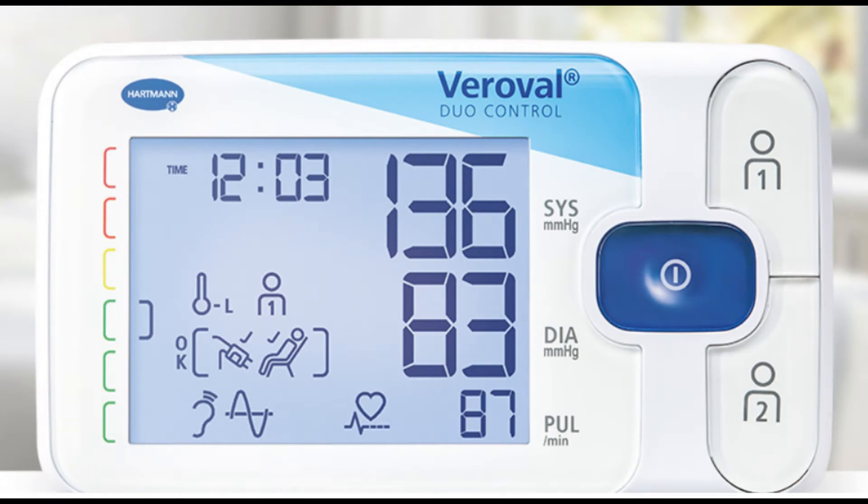The Variable Duo Control can be used by two persons, and the monitor will save 100 readings in memory with date and time for each of the two users. The Variable Duo Control Monitor can also measure a guest's blood pressure, but the data is not saved in the device.